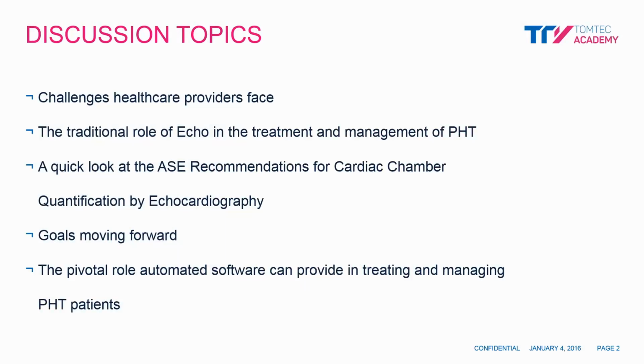Discussion topics today will include challenges providers face in the treatment and management of patients suffering from pulmonary hypertension, the role echocardiography has traditionally played in the management of pulmonary hypertension, a quick look at the ASE's updated guidelines and standards publication regarding the right ventricle, goals moving forward, and last, the role automated software can provide in regards to the automation and subclinical marker of longitudinal strain.